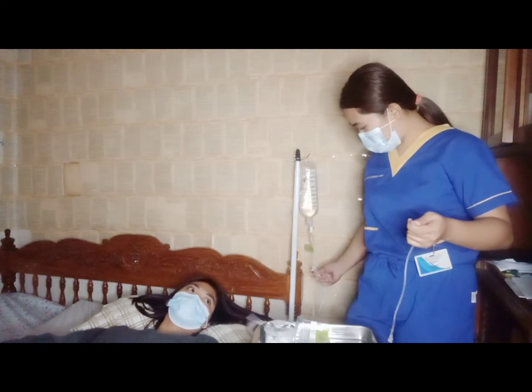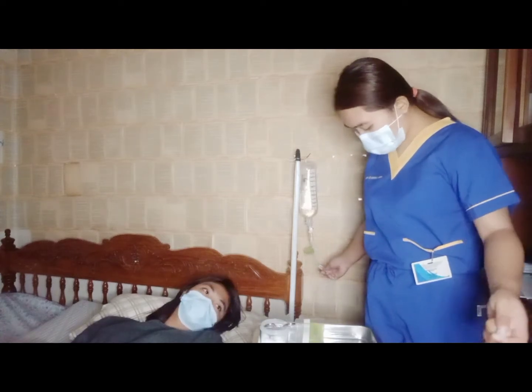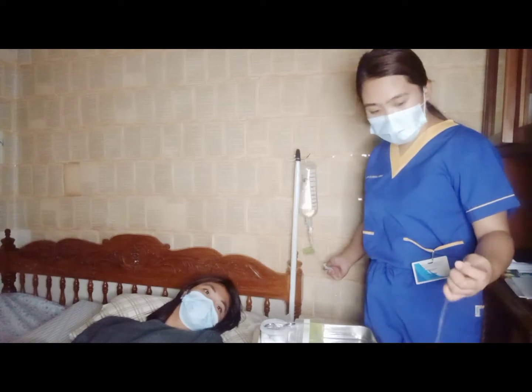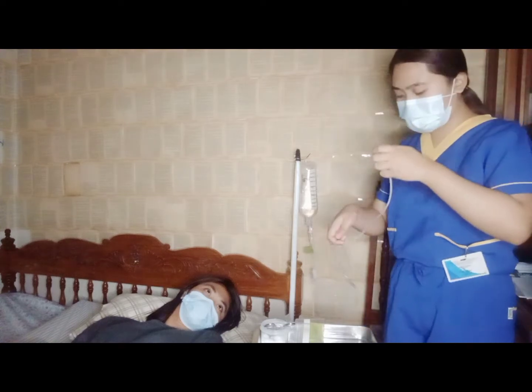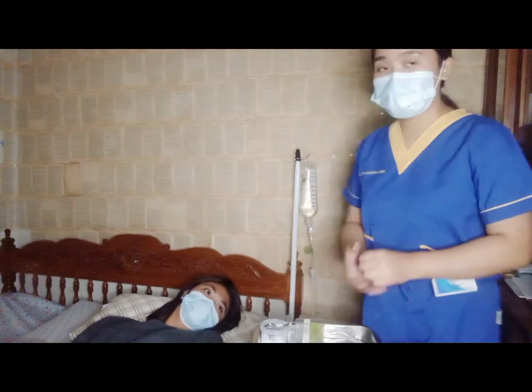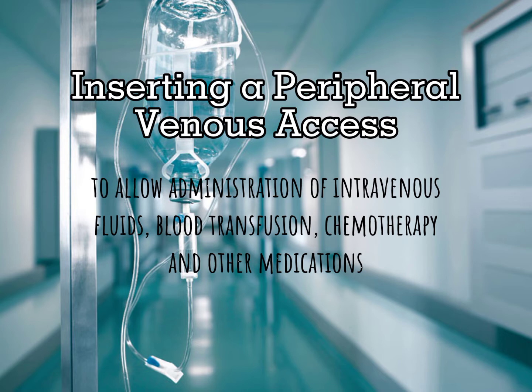So, let's open it. Observe if the air bubbles disappear. Then close the end cap and close the clamp. Then you will reserve it for later use. Let's move on to the next procedure, inserting a peripheral venous access to allow administration of intravenous fluids, blood transfusion, chemotherapy, and other medications.